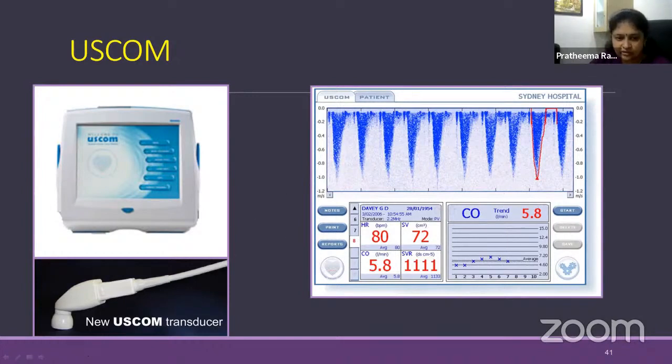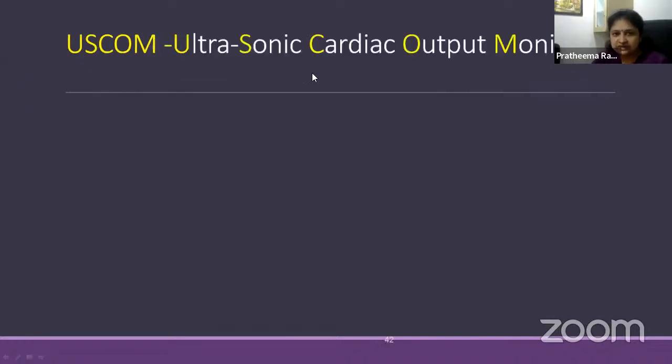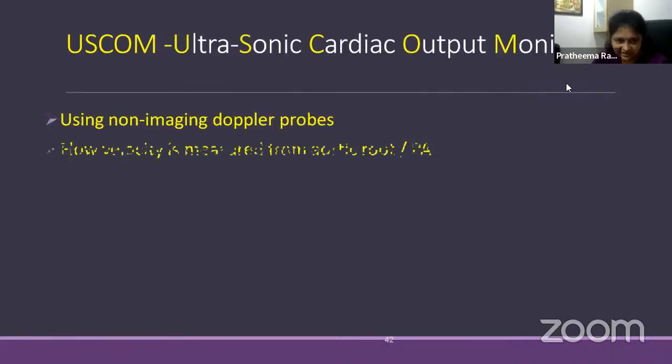Okay, so this is how it looks. It is a USCOM transducer. USCOM is ultrasonic cardiac output monitoring. The transducer is non-invasive. It's a non-imaging Doppler. It is not going to image. It is just a waveform which is seen.